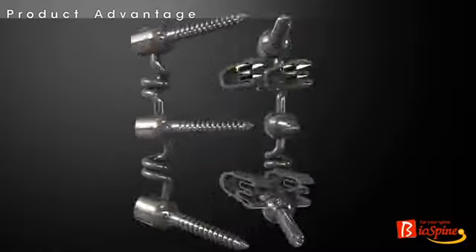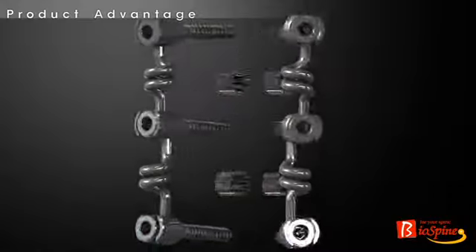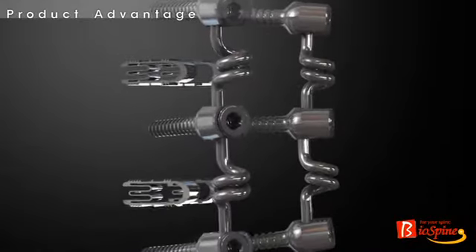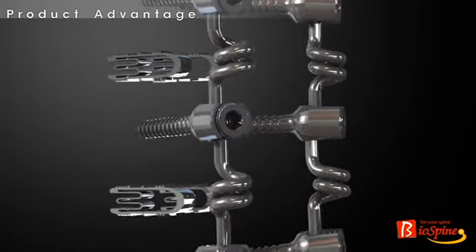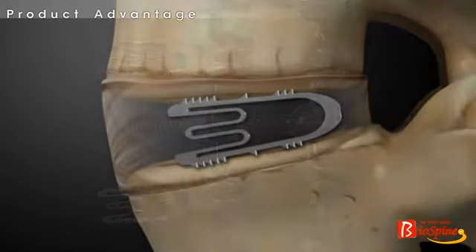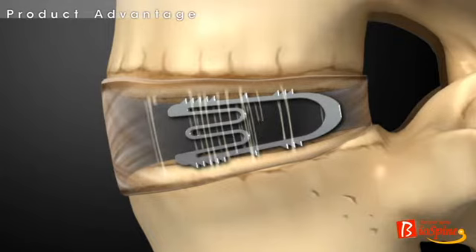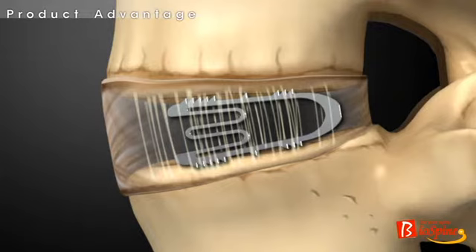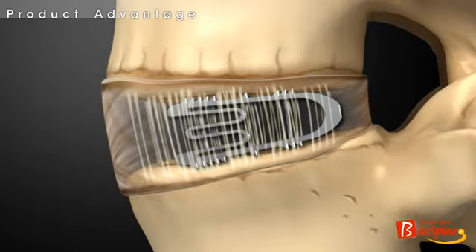A higher fusion rate of the anterior part can be achieved by the flexible cage system. In the combined case of the BioFlex spring rod system and the flexible cage system, since the change of material and design makes flexibility enhanced, we can expect a load transmission mechanism similar to the normal. Thus, continuous micro-motion and stimulus are applied to the contact surface between the surface of the flexible cage and the end plate of the vertebral body, so that secondary bone formation can be promoted by Wolff's Law, without the help of bulky anterior support. Therefore, we do not have to be concerned about cage migration.